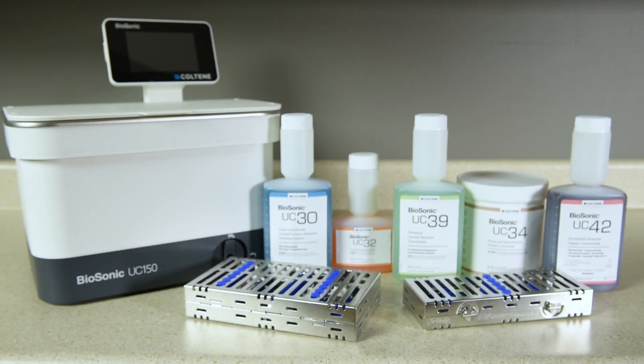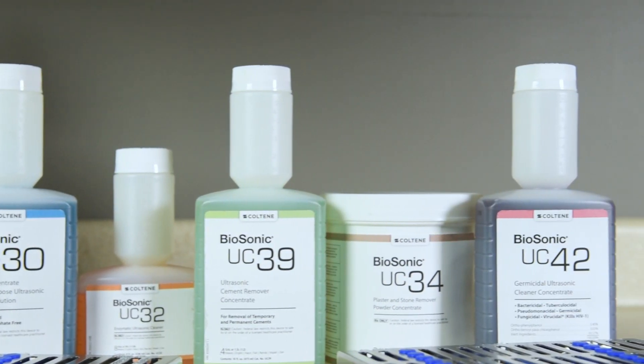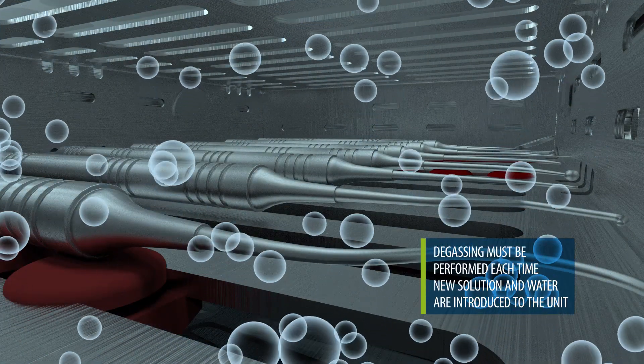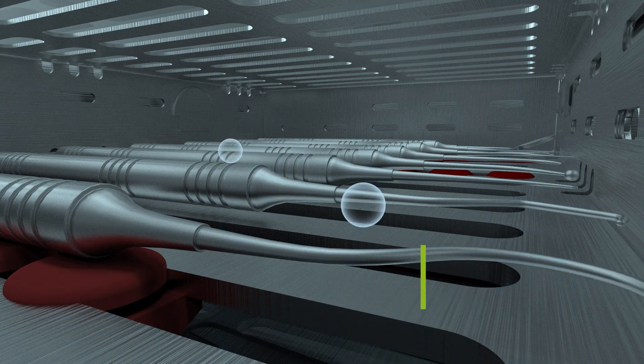Degassing is a process that eliminates large air bubbles in a solution that interfere with a cleaning process. Before cavitation can become effective in an ultrasonic cleaner, the gas trapped in the liquid must be removed. If it's not removed, the cavitation bubbles will fill with gas, cushioning the implosion force.